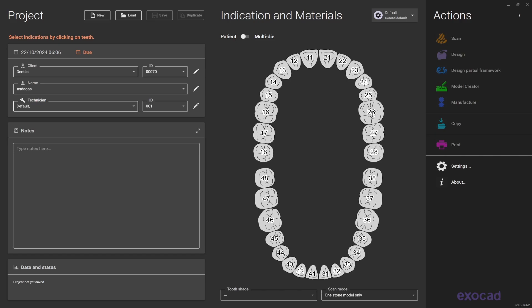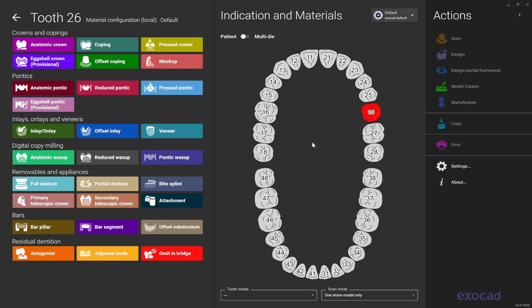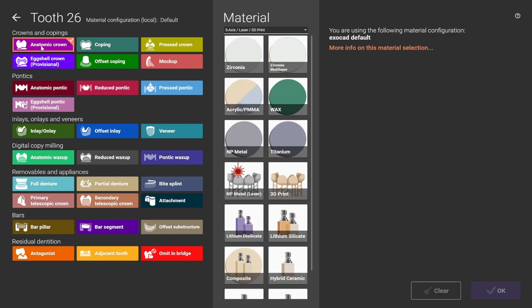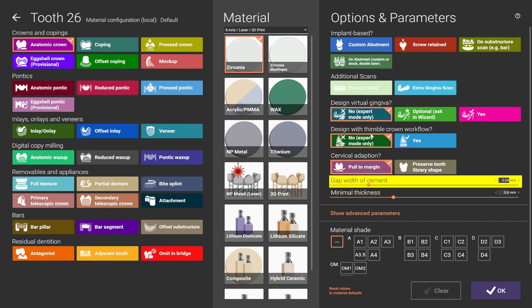Now select the crown you want to do. If you are looking for full contour, select an anatomic crown. For this example we're going to select zirconia, and at this stage you can change the cement cap if you want.